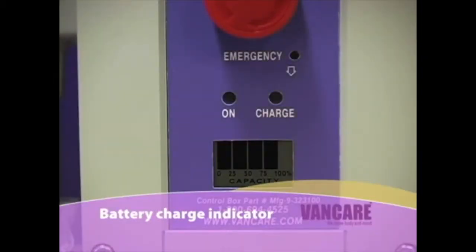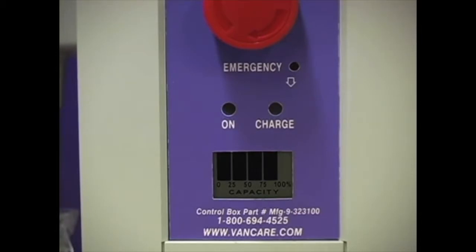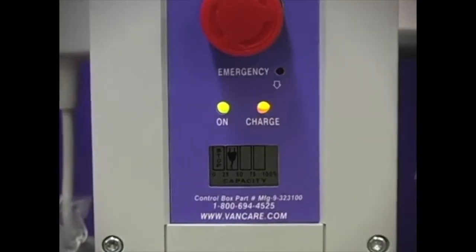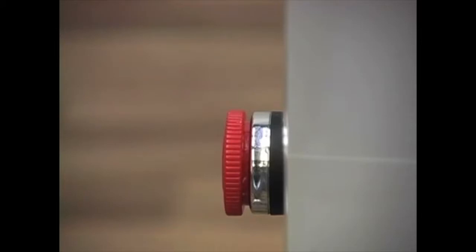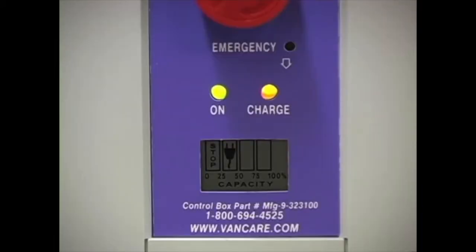Battery charge indicator. The battery charge indicator gauge is located on the back of the battery control box. When the battery is fully charged, 4 bars are shown. At 75% charge, 3 bars are shown. When the battery is discharged, the plug symbol is shown. When the emergency stop button is pushed in or the lift is plugged into charge, the battery pack gauge also indicates the battery pack is discharged.